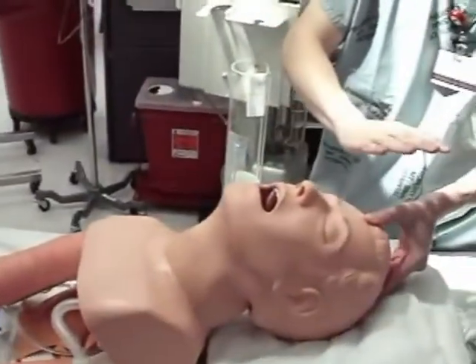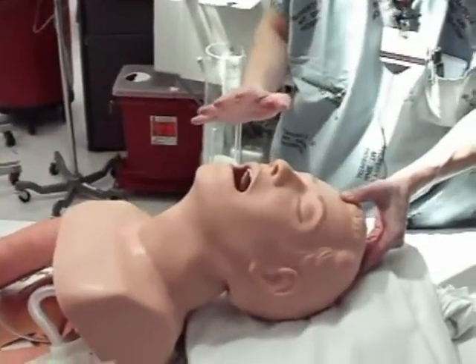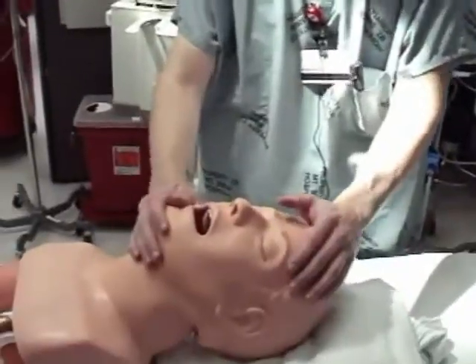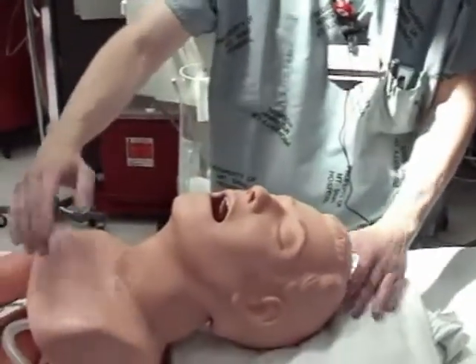Once you've achieved that alignment, tilt the head back as far as you can — that is true sniffing position, and it will optimize your intubation. Sometimes you'll have a difficult airway, call anesthesia, and they'll come down, properly position the patient, and get it on their first try. So before any intubation, crash or not, ideal positioning will optimize your first-pass success rate. That's incredibly important because every pass you make increases the potential for the patient to vomit or for airway swelling.